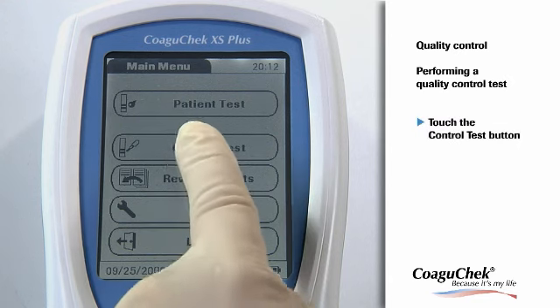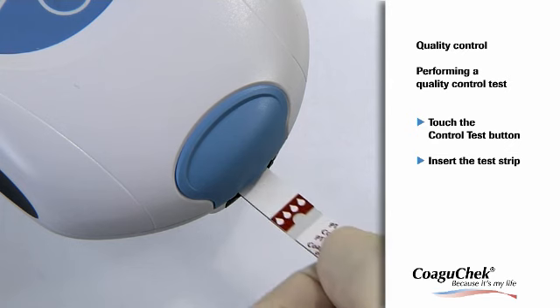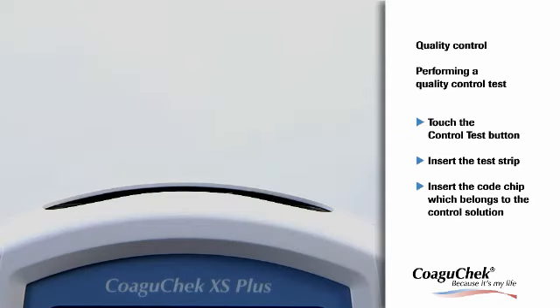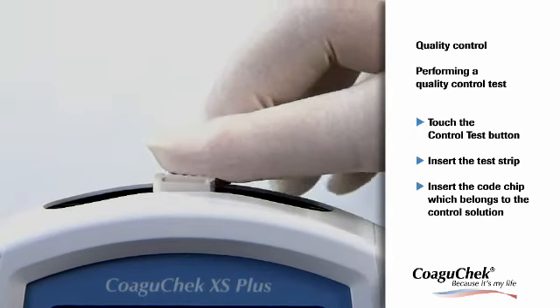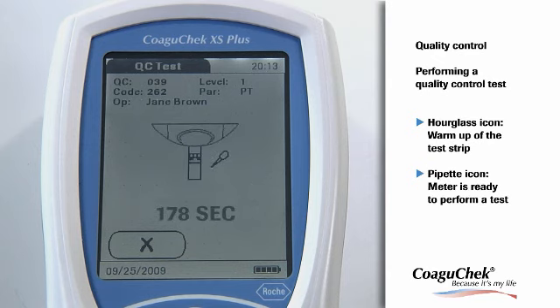Please touch the Control Test button. The test strip icon prompts you to insert a test strip. Slide the test strip into the test strip guide. Now you have to insert the code chip belonging to the control solution. The hourglass icon shows that the test strip is warming up. Afterwards, the pipette icon flashes to indicate that the meter is ready to perform the test and is waiting for the sample to be applied. At the same time, a 180-second countdown begins. You have to apply the sample within this time frame.